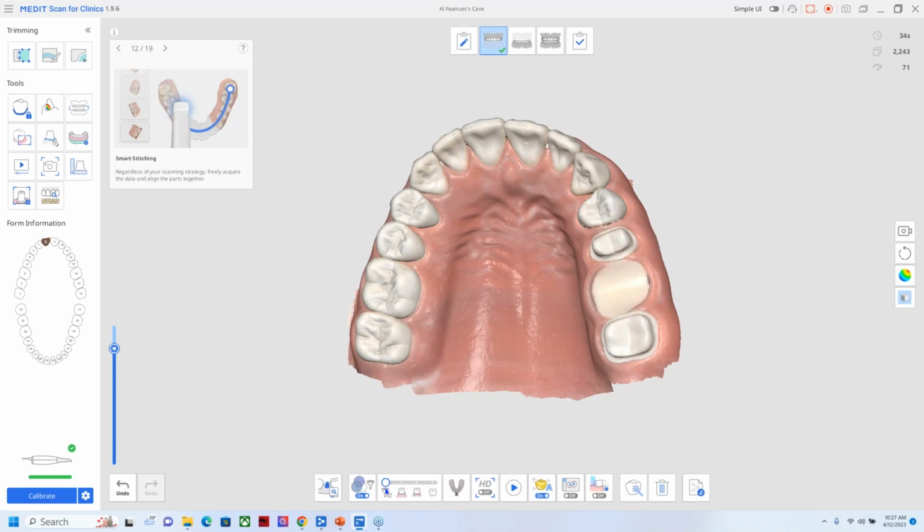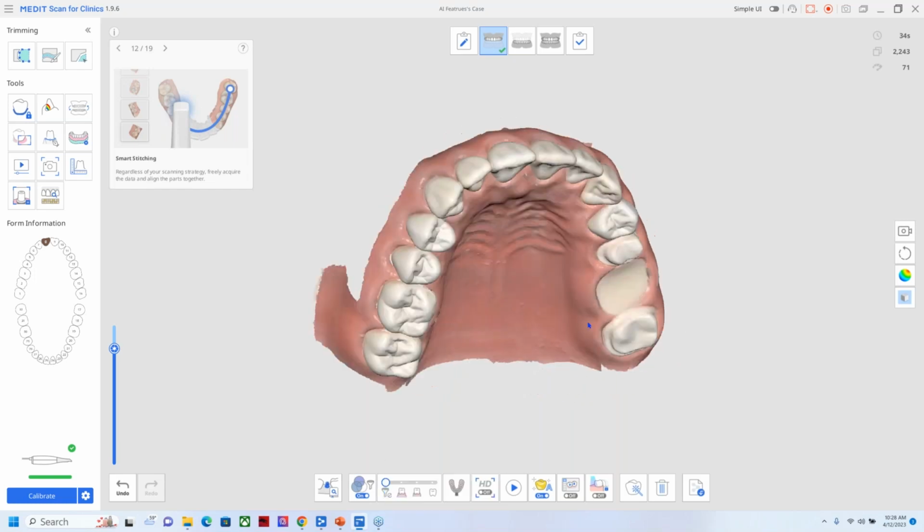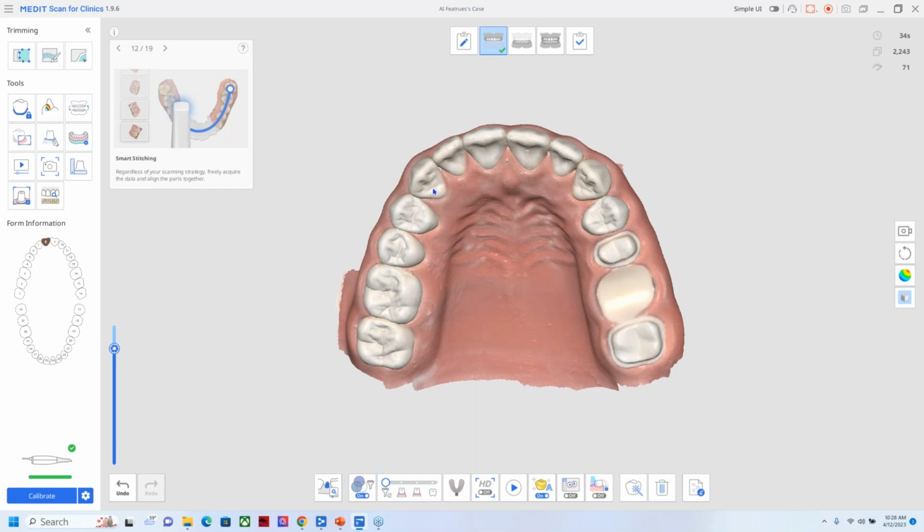Now let's go ahead and bump this filter to the left. So right here, we're on no filter. This is option one, the soft tissue will remain intact. So this is actually not going to filter out any soft tissue. This option is great for scanning recessed gingiva areas or border areas. The soft tissue will not be filtered out. It's best to use this feature while scanning an edentulous patient. So if there were no teeth, it does not filter tissue, so it gives you a better chance to pick up that scan data in an edentulous area.